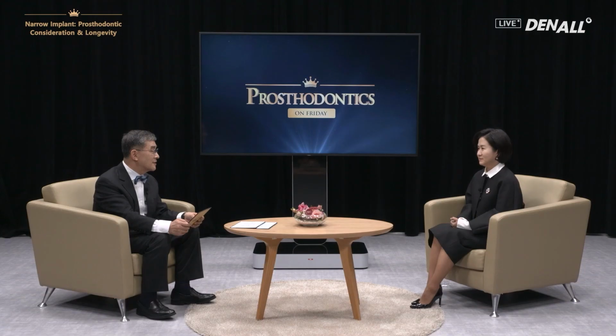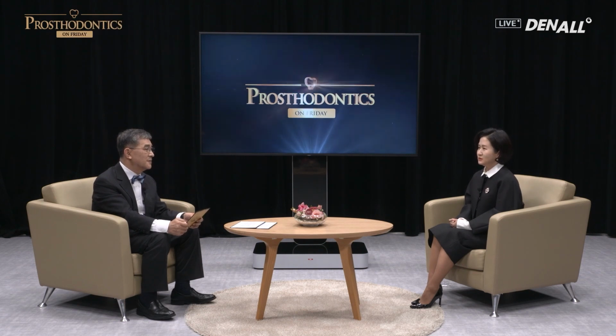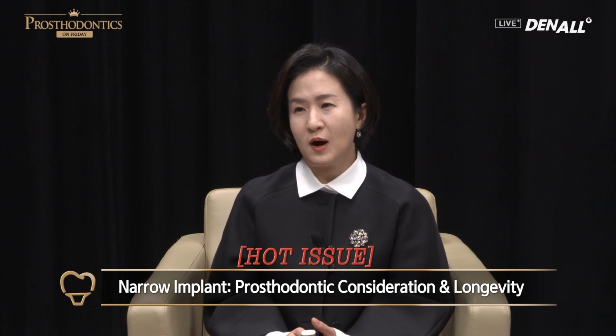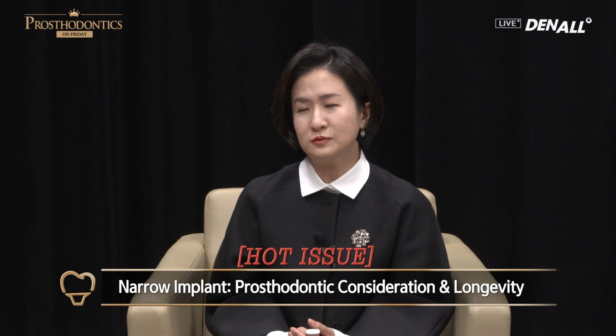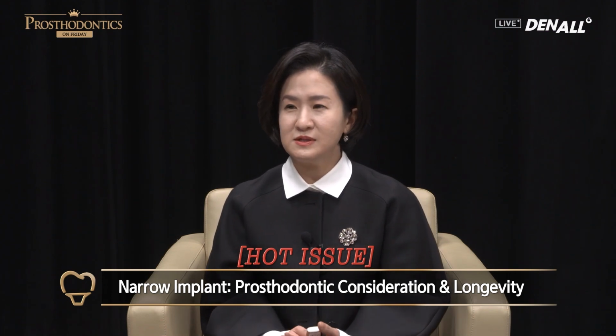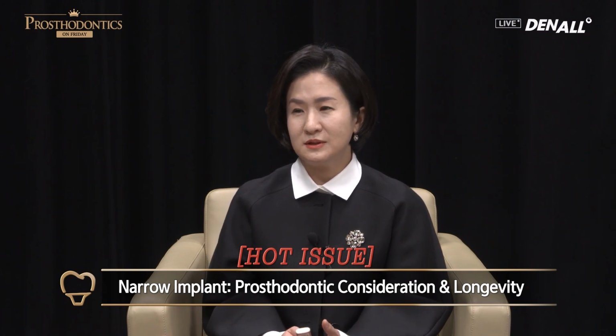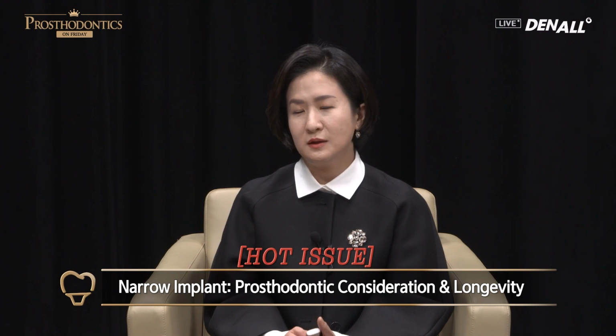Would you briefly explain what you are going to talk about today? Today, I'm going to talk about narrow diameter implants. Recently, implants and dental materials have advanced, and implants are placed in more senior patients. When we have to do bone grafting, we need to pursue a minimally invasive approach, so the demand for narrow diameter implants is increasing.